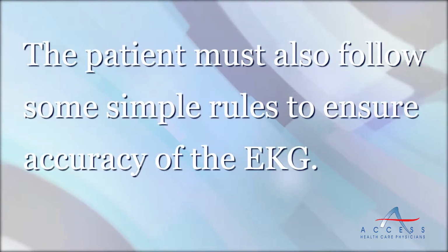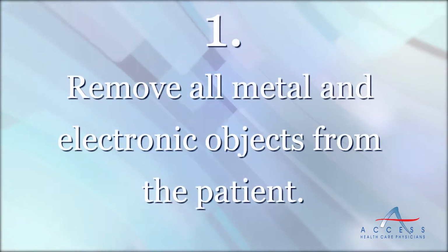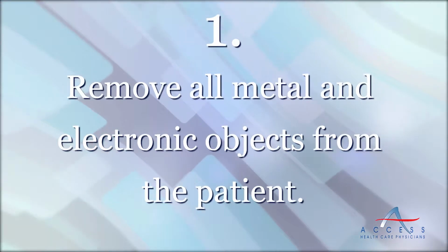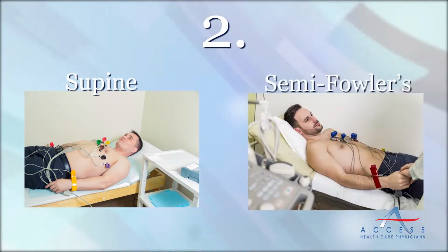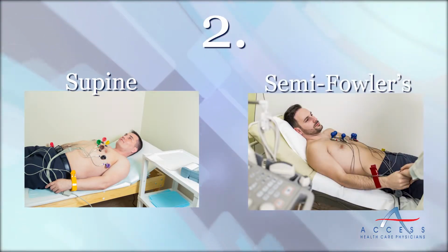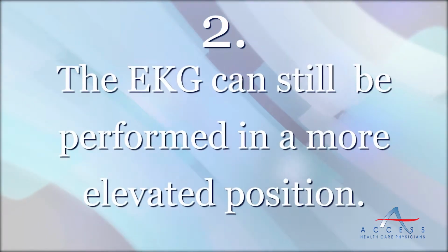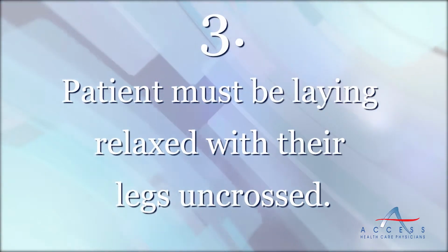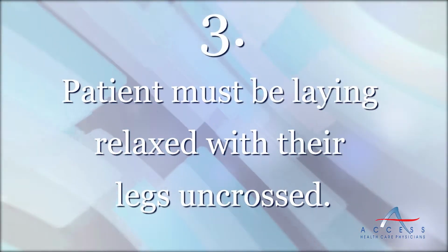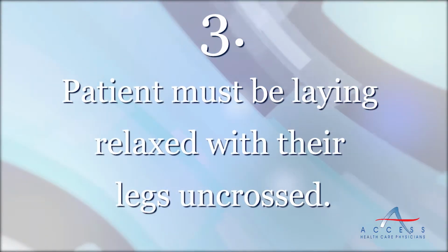When it comes to patient positioning for the 12-lead EKG, you need to: 1. Ensure that all electronic devices and metal objects are removed from the patient. 2. Place the patient in a supine or semi-Fowler's position. If you're unable to place the patient in either one of these positions, you can perform the EKG with the patient in a more elevated position. 3. Have the patient lay flat with their arms by their sides, and ask the patient to relax their shoulders and keep their legs uncrossed.